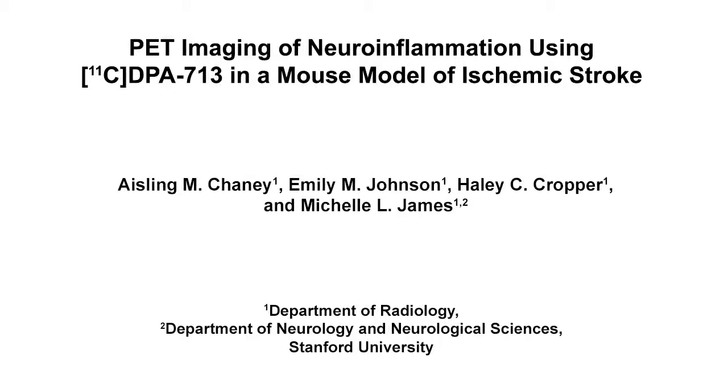The overall goal of this experiment is to accurately quantify the spatial distribution and extent of neuroinflammation in a mouse model of ischemic stroke using TSPO-PET and MR imaging, and to validate these in vivo findings using ex vivo autoradiography.